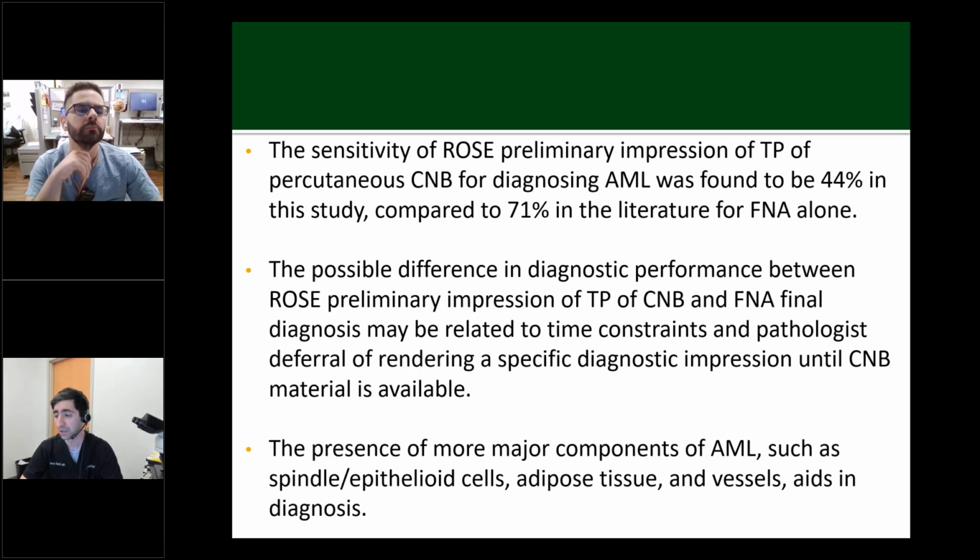The potential difference in diagnostic performance between the touch prep and the FNA may be attributed to the nature of on-site evaluation, which may not allow for thorough review of cytology material, as well as other information such as clinical and radiologic information. Moreover, the pathologist's deferral in providing a specific diagnostic impression until core needle biopsy material is available likely contributes to the differences observed between the touch prep and the FNA.